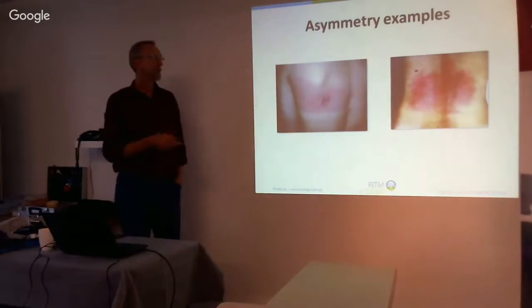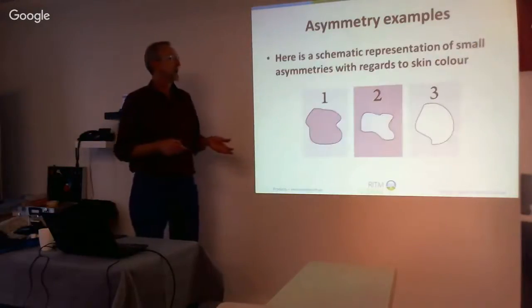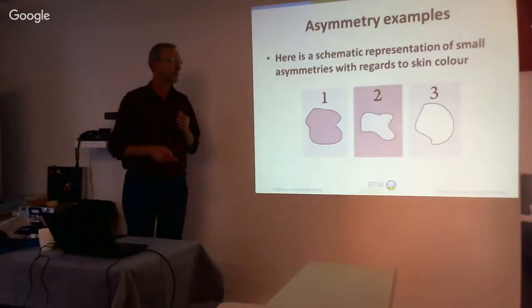And often you can see it like this, but more often you can actually feel it with the stickiness on the patient. So here, once again, either the area gets darker or gets paler or changes color in comparison to the surrounding here.